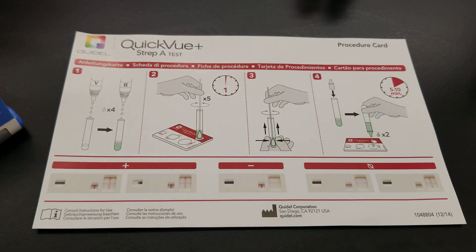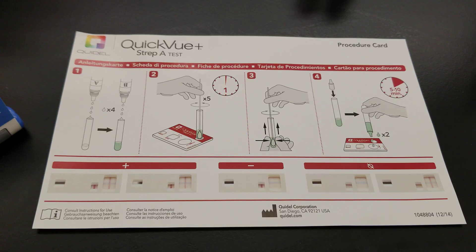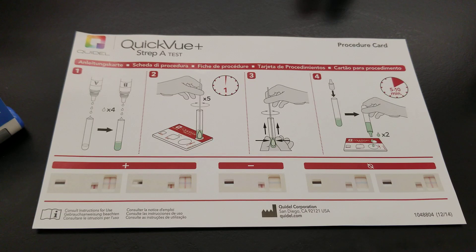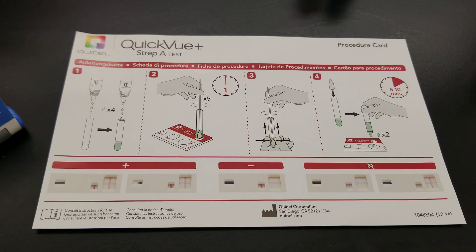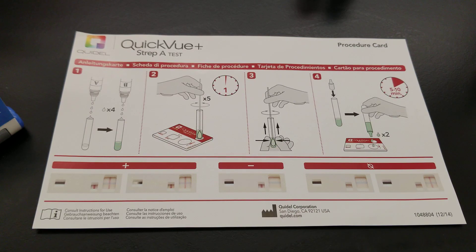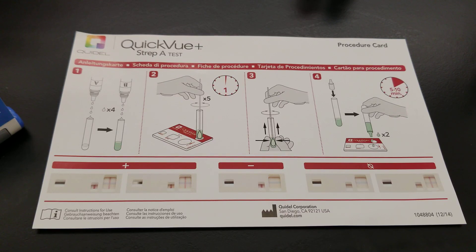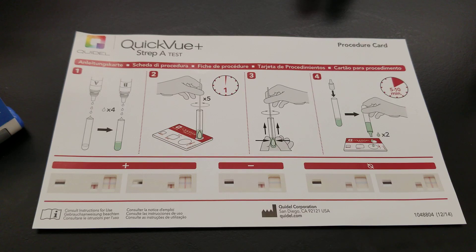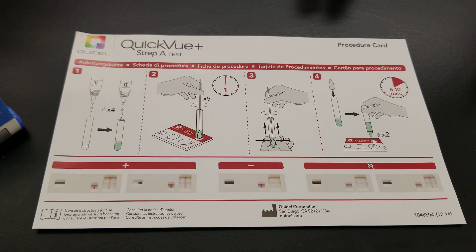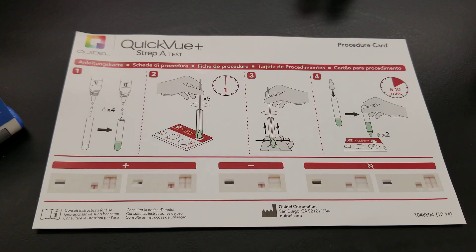You make sure to depress the patient's tongue and only touch that swab onto the affected tonsils and back of the throat area. It would be very red, could be pussy, could have white colonies on there. Send it immediately for this rapid test, or if it's negative and you still want a culture, send it out for culture. Get a new swab — do not use the same swab that was used in this rapid test procedure.